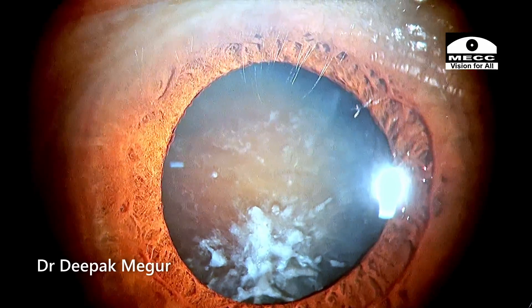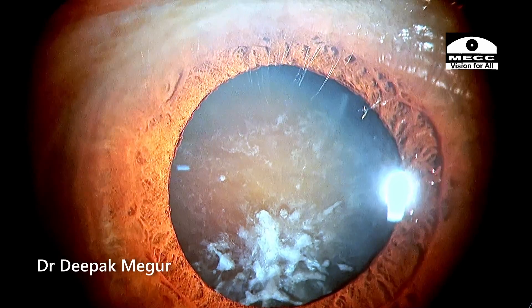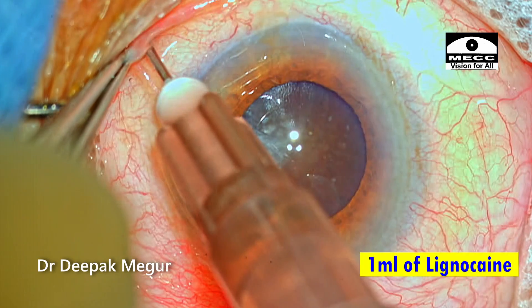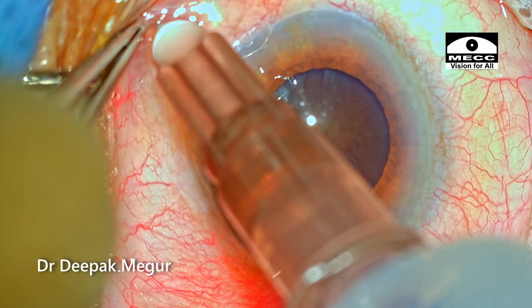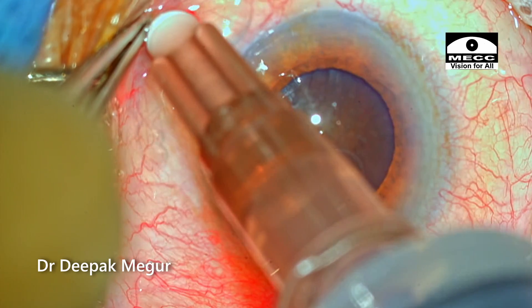If I can get the rhexis right, dealing with this hard nucleus is not going to be a major issue. 1 ml of lignocaine is being injected in the inferior medial canthus using a 26G needle in the sub-Tenon's space.